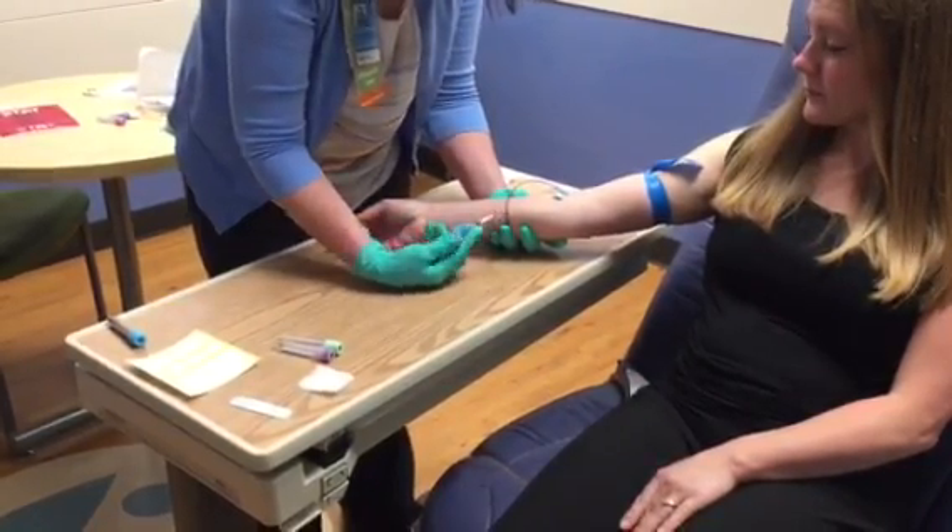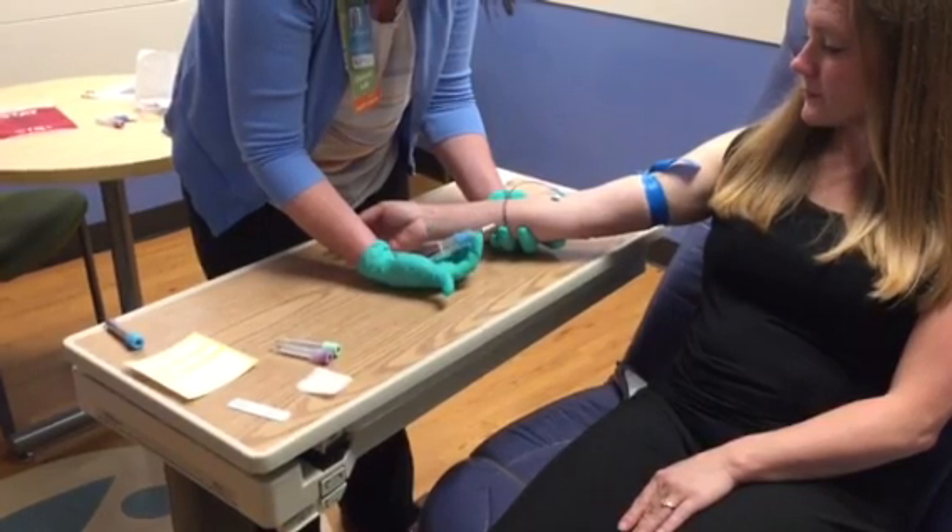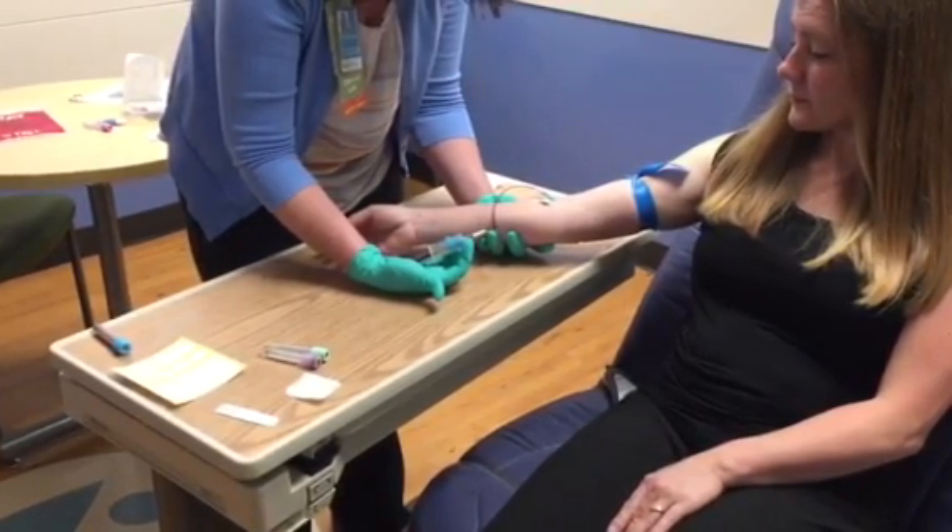You'll collect your specimen tube, allowing the blood to flow until the vacuum in the tube stops on its own.